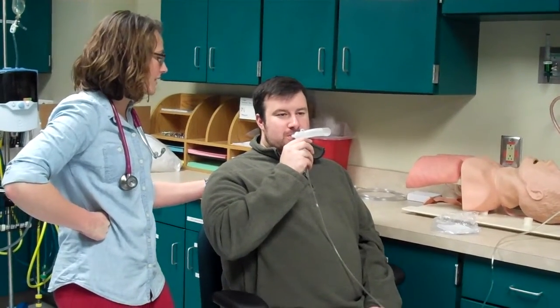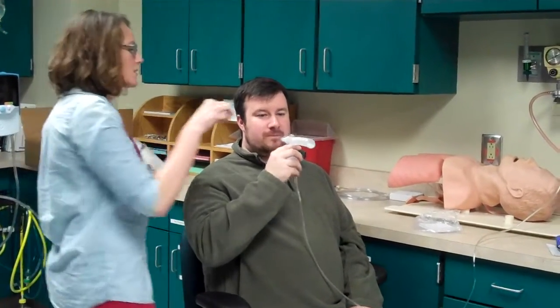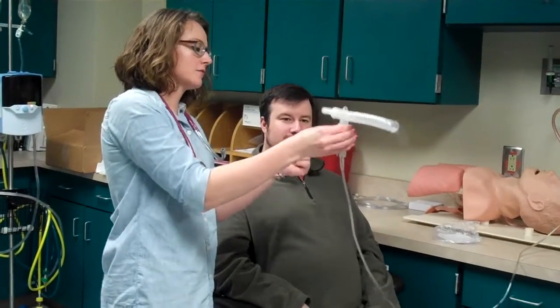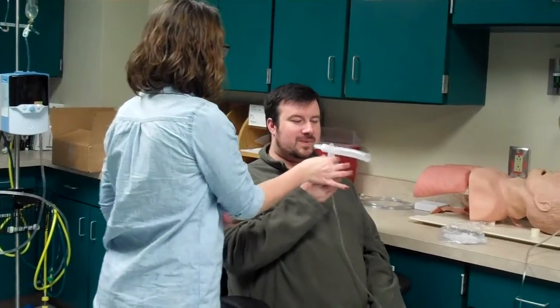We're going to take a deep breath in. Deep, deep. Hold it, hold it, hold it. Alright, and let it out. It's starting to sputter right now. Alright, and since it's sputtering, let me see that for just a second. I want to make sure we get all that medicine in there. There you go.